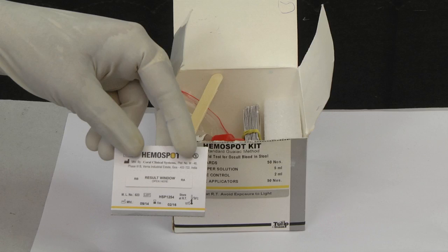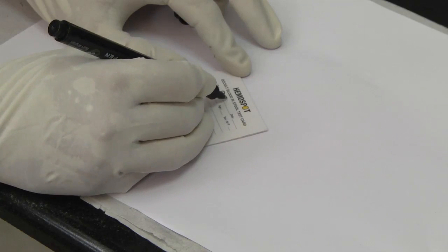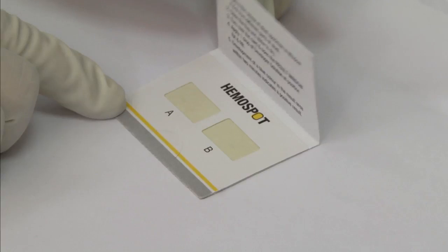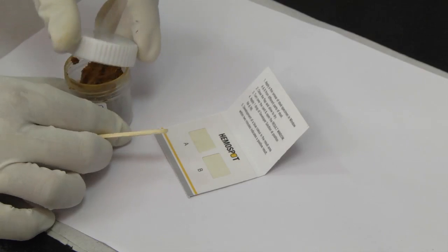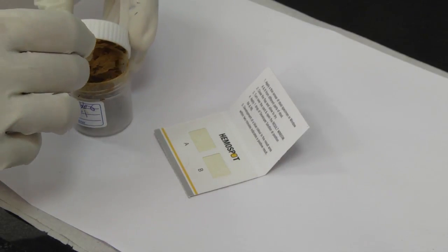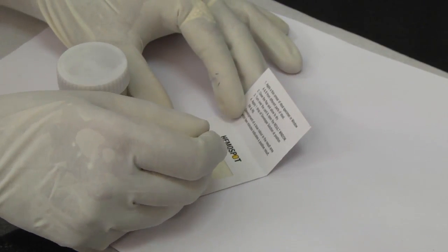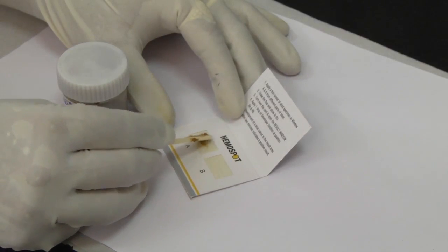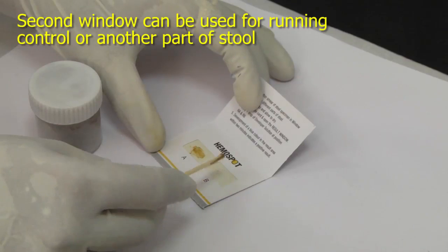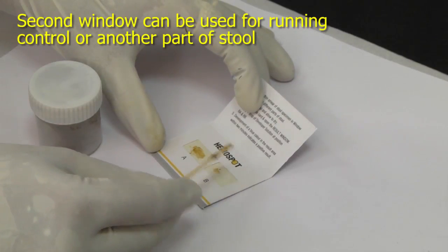Procedure: retrieve the required number of test cards to perform the desired number of tests. Label the cards with correct patient identity. Open the sample application windows labeled A and B respectively to expose the reactive surfaces of the test card. By using the sample applicator provided in the kit, spread a very thin layer of stool on the reactive surfaces on the window A. Similarly, on window B from a different part of the stool.